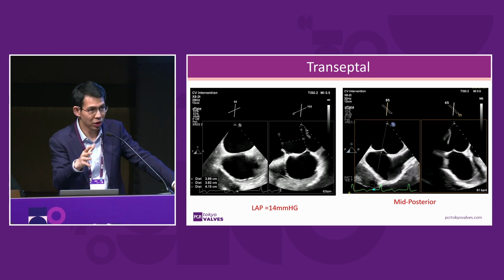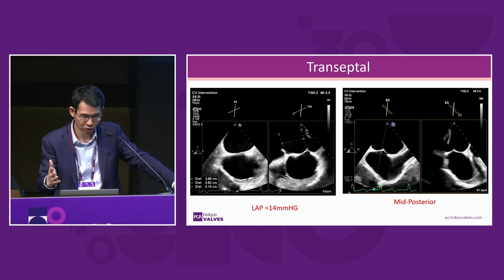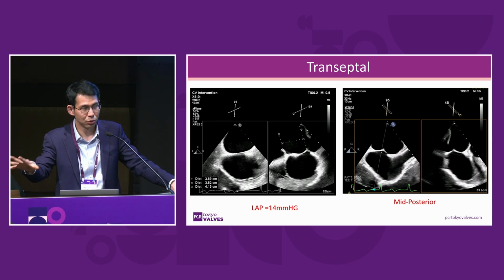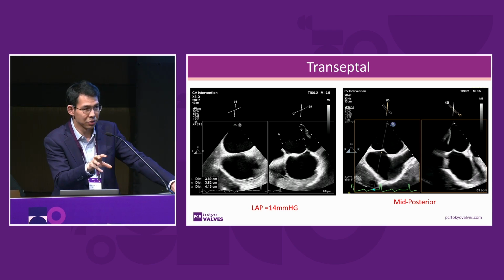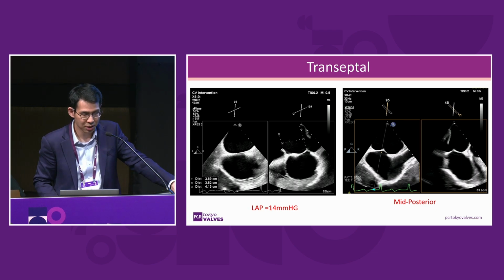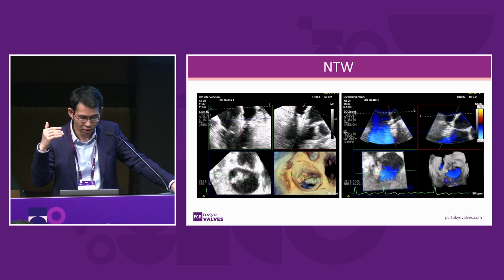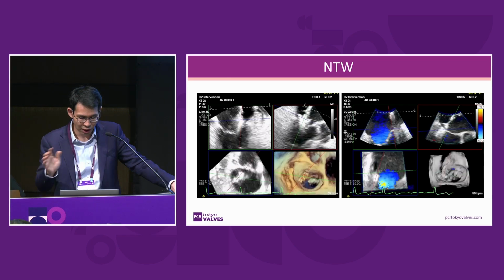In our case, the left atrial appendage morphology, luckily, is not very challenging. So we take a mid-posterior transeptal location. I'll show the left atrial appendage morphology later. So that's a decision based on a hybrid of morphologies. One is the mitral valve morphology, which in this case is not particularly challenging. The other is the left atrial appendage anatomy, which is not particularly challenging either. So we decided to use the same transeptal access. The commissure pathology is not the main focus. I know Adam is going to show us another challenging case, so I won't focus on that.